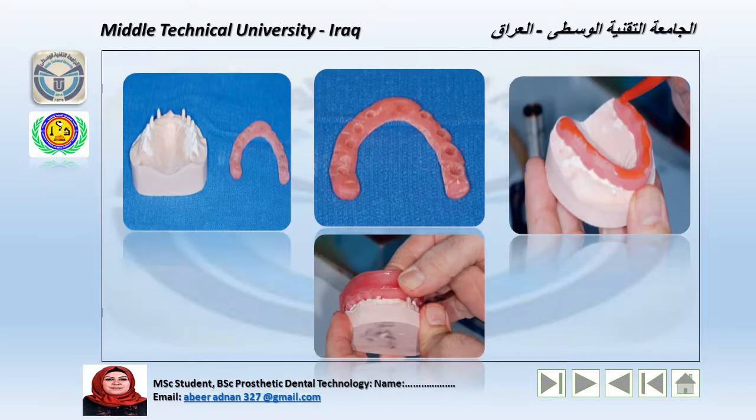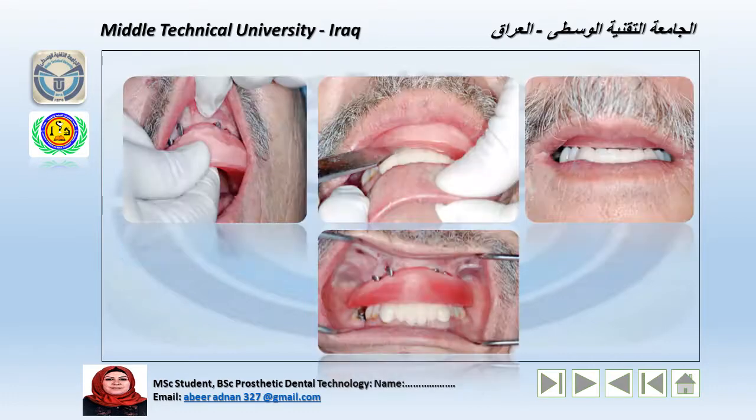After taking the stone model, now we use it to make a light cure base plate. The base plate engages only the top of each abutment. Stick wax is applied to the base plate to ensure the wax pattern or wax rim is attached to the base plate. After the wax rim is added to the base plate, the wax rim is placed in the patient's mouth.